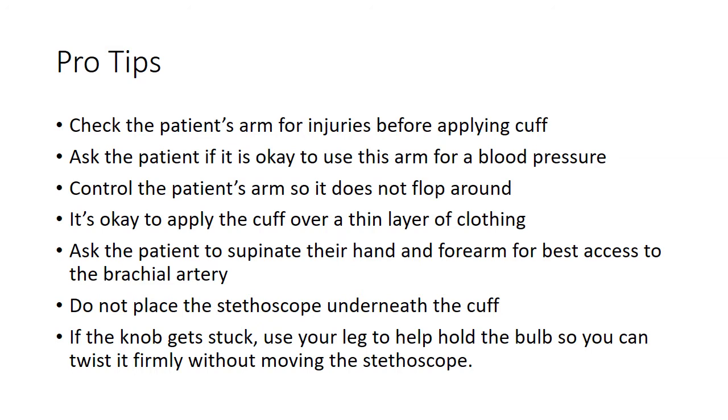Some pro tips for obtaining blood pressures. Check the patient's arm for injuries before applying the cuff, and ask the patient if it's okay to use this arm, as some patients may have pre-existing conditions. Control the patient's arm so it doesn't flop around. It is okay to apply the cuff over a thin layer of clothing. Ask the patient to supinate their hand and forearm for best access to the brachial artery.